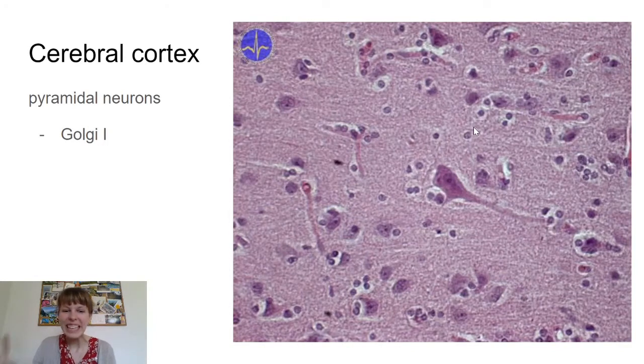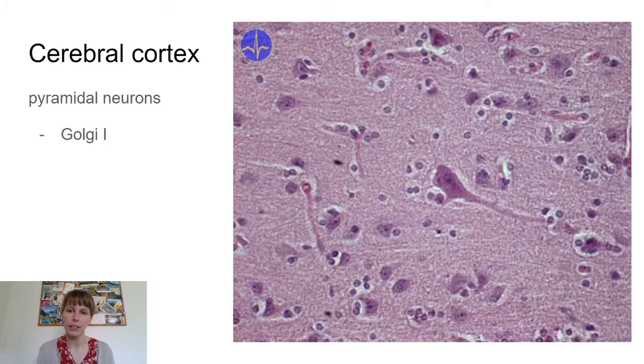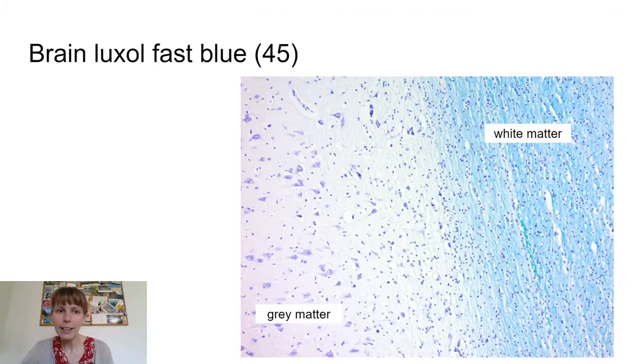Unfortunately, the histology guide doesn't have hematoxylin eosin stained brain cortex. So for hematoxylin eosin, you just have to either Google it or let's wait for the quarantine to be over and you can take a look, hopefully until the end of the semester on your own. But we will take a look at a different staining on the histology guide. And the other staining that you would have in your slide box, but we don't have on the histology guide, is the Luxol-Fast blue.